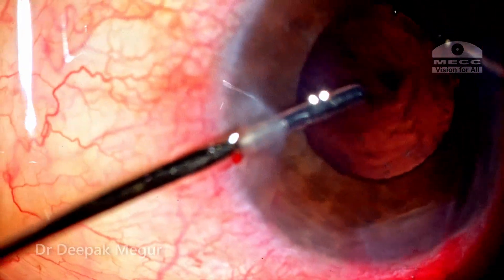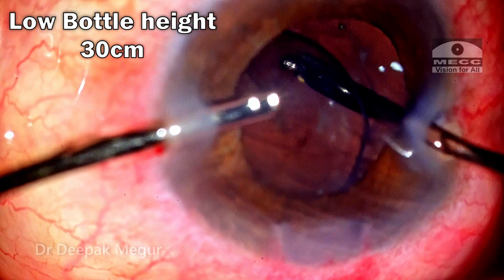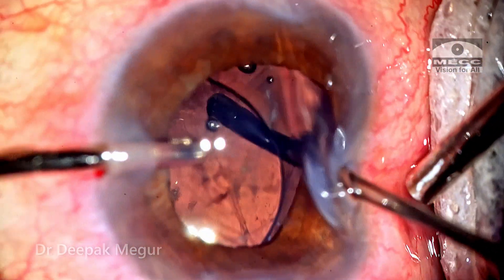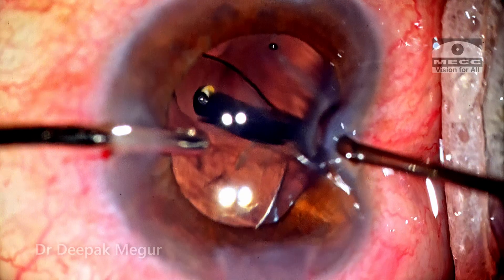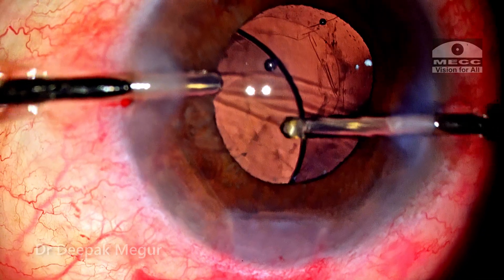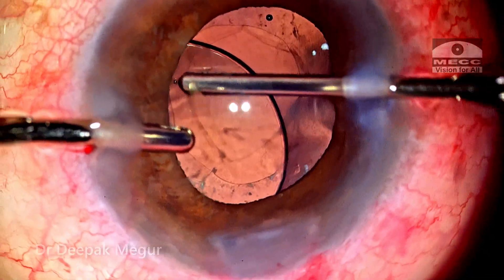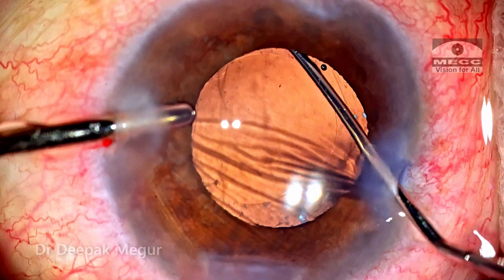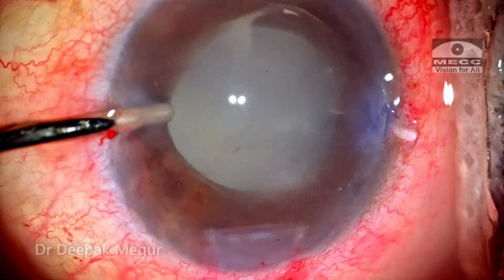In a vitrectomized eye, whenever we want to enter, it's always mandatory that the bottle height be kept very low. I keep the bottle height at 30 centimeters as I'm entering, because if we go in with a very high infusion pressure, the chamber can suddenly deepen and there is a real risk that the posterior capsule opening can enlarge and the lens can drop down. Going in with a very low bottle height is extremely important; once aspiration kicks in, you can gradually increase the bottle height. The vitrector is introduced behind the lens and the viscoelastic and some blood are cleared off in a couple of minutes.